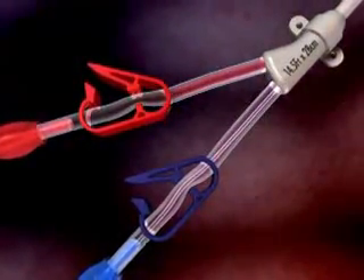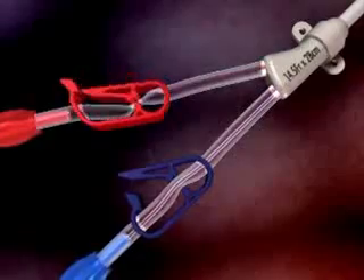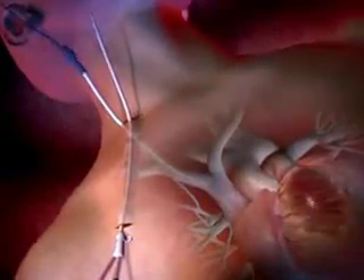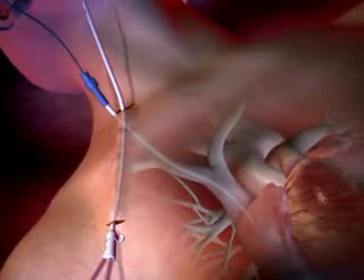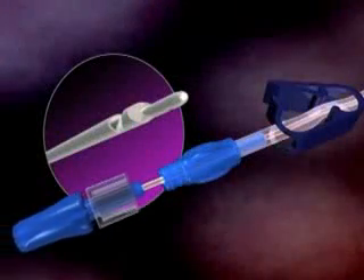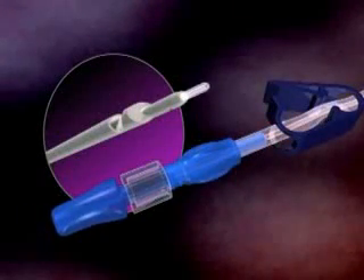Flush the arterial lumen of the catheter with saline and clamp the extension. Thread the dilator over the proximal end of the guide wire and advance until it is in the target vein. Remove the dilator, maintaining the guide wire's position. Advance the stylet so that it protrudes from the catheter tip.